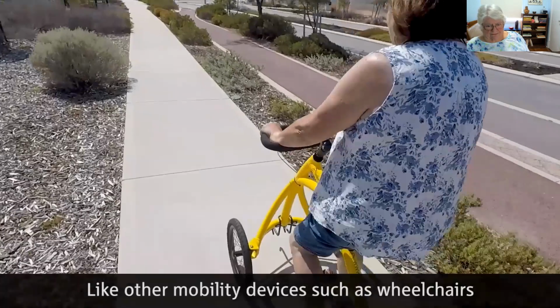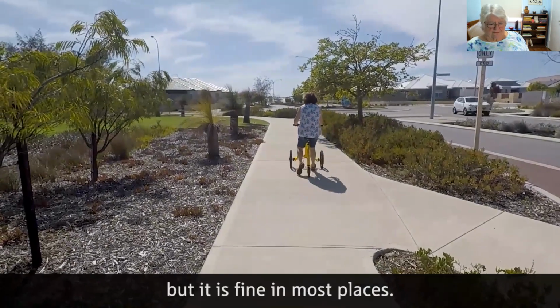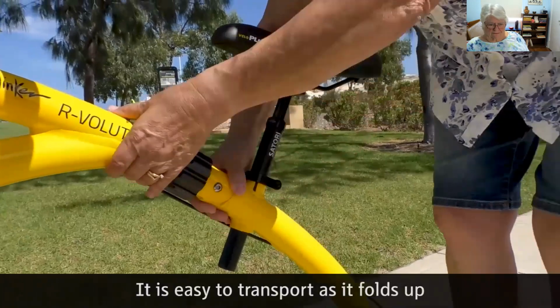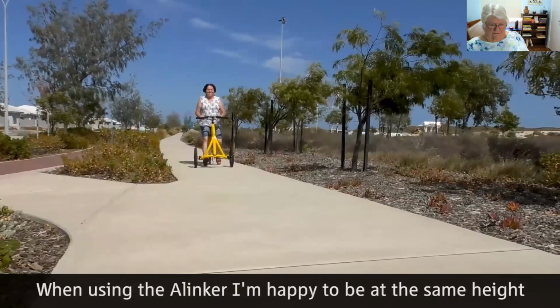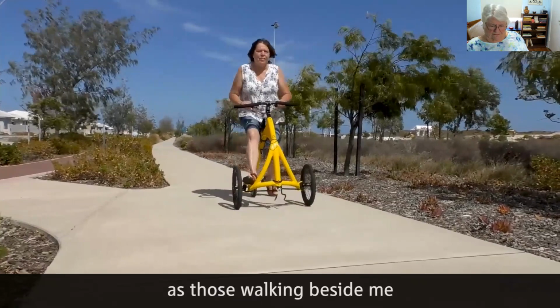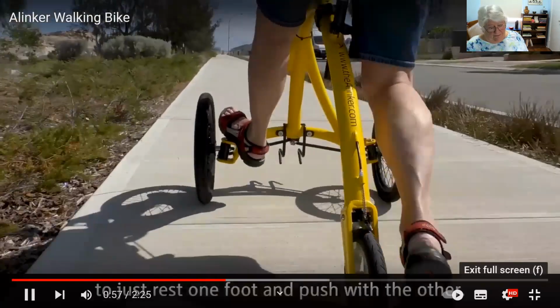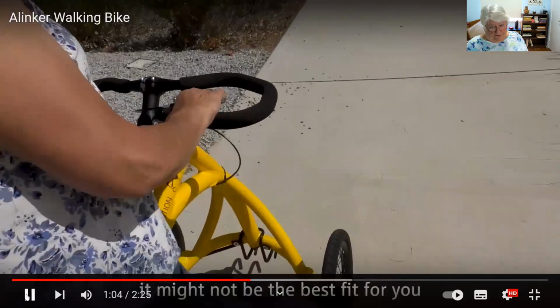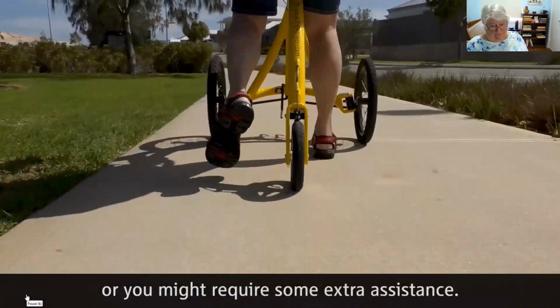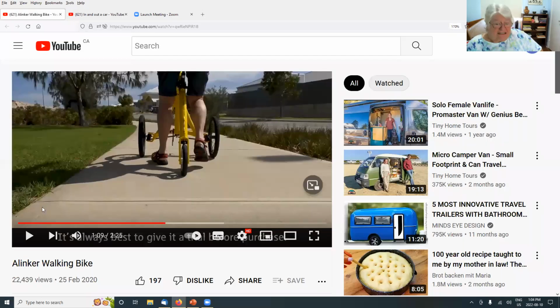Like other mobility devices, such as wheelchairs, it can be a bit too wide to get through some shopping aisles, but it is fine in most places. It is easy to transport as it folds up and the 2 front wheels detach as in a wheelchair. When I'm using the Alinker, I'm happy to be at the same height as those walking beside me, and I feel I get a good workout from it. And if my legs get tired, I find it best to just rest one foot and push with the other. If you're not used to riding a bike or scooter though, it might not be the best fit for you, or you might require some extra assistance. It's always best to give it a... So I'm stopping it there just because it gives you an idea of how it runs. And we'll go back to my presentation.